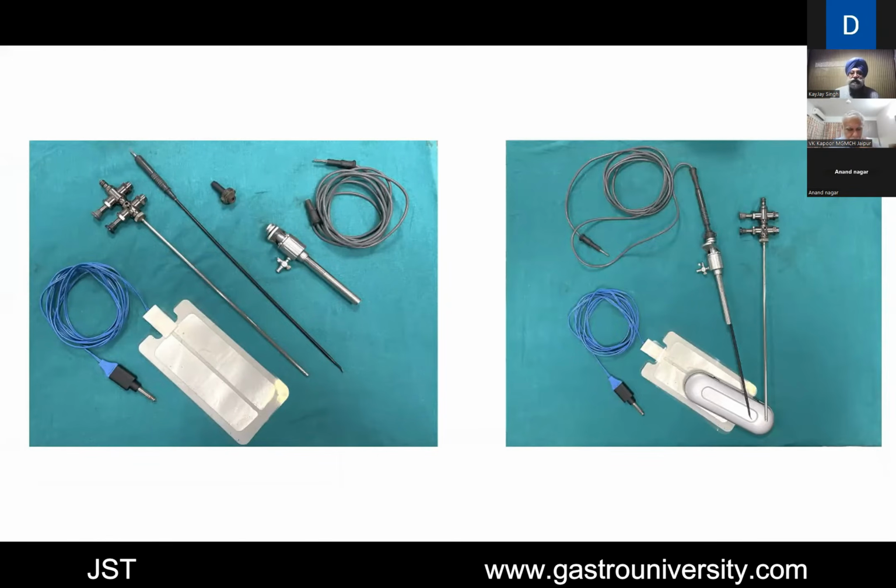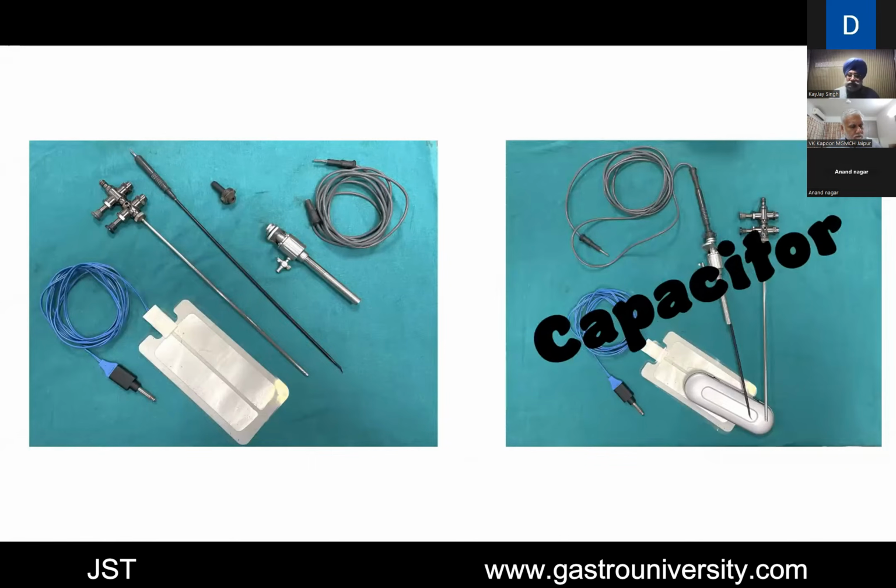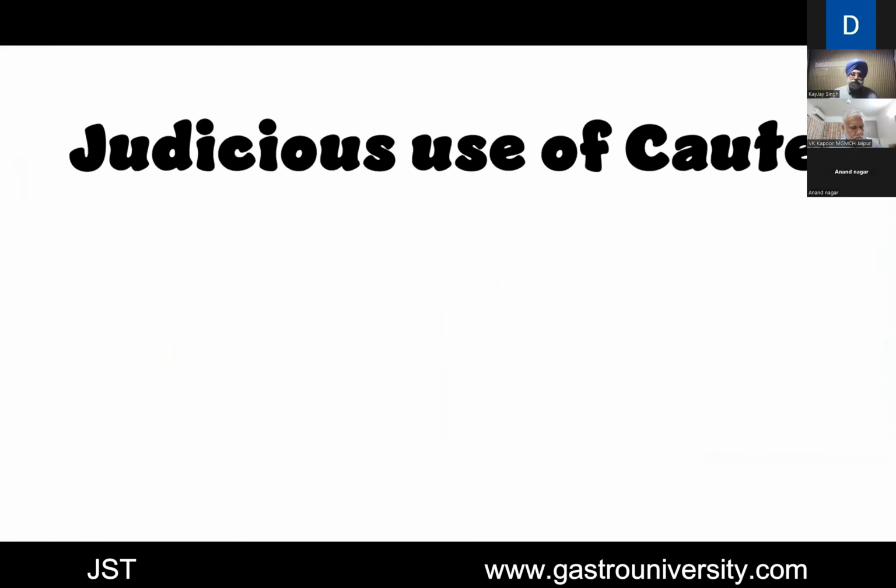This becomes an electrical capacitor. I will tell you how. This becomes an electrical capacitor, meaning that this part can hold a lot of energy without your knowledge. And that's where we land in trouble.